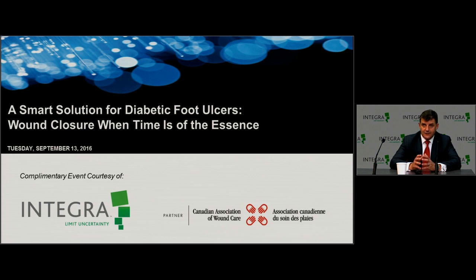And we know what that data looks like, and that data looks like about 60% or so over a period of time. With that in mind, adding a dermal regenerative template in that with adequate offloading is going to make a significant improvement most likely. So I think our goals here should be to heal 99% of people. So with that in mind, the Founders trial, what it's looking at is good offloading and using IDRT therapy, but there's not a single diabetic foot ulcer trial that is using a product and also uses total contact casting or even PTBs, because you can't enroll patients in those trials. These patients will refuse to wear a cam walker or a Royce walking type boot. So trials always have moderate offloading in them.